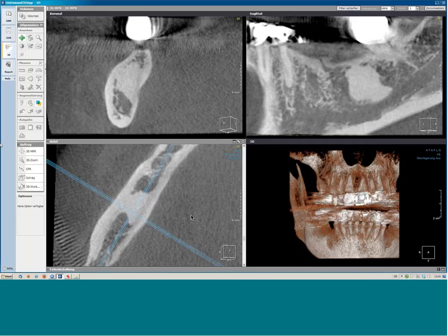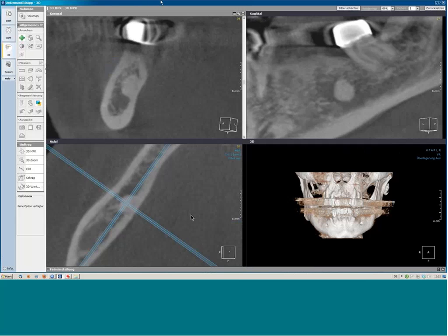And another one, a smaller lesion, which could also be displaced compact bone, or in a similar shape, could also be a bone scar. There are a lot of lesions like that, so just check how large they are, and if you can, avoid putting the implants inside of these kinds of lesions.